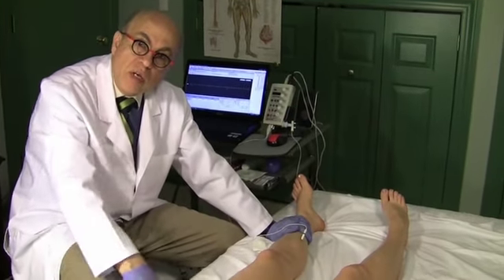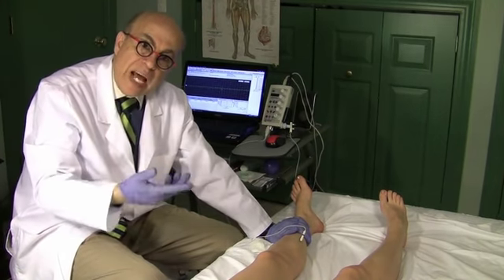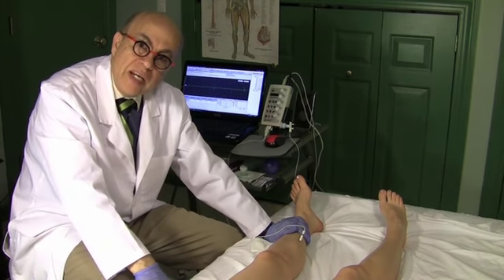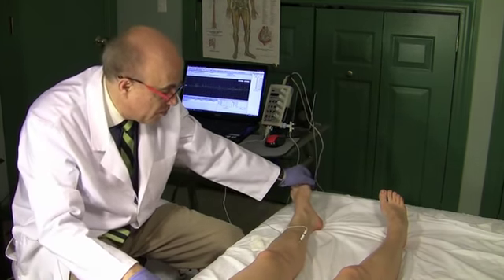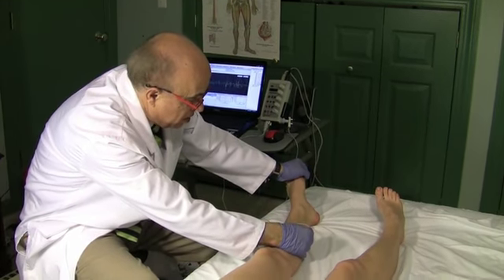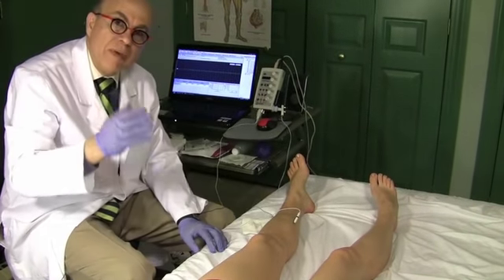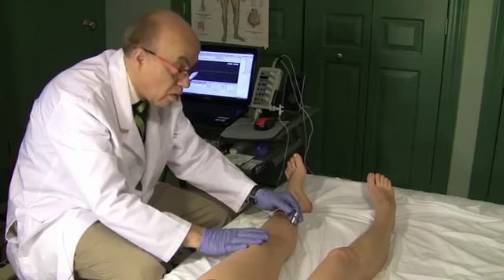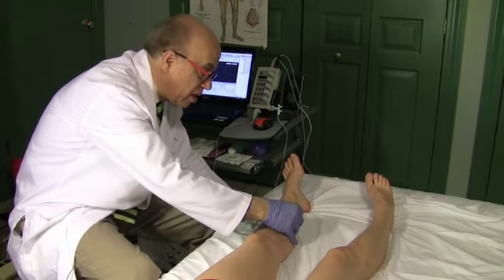One thing I always recommend to my students and residents is whenever you're doing studies, get yourself used to listening to the sound of the motor unit to recognize the normal just by sound versus abnormal. Push down on my hand. And this is a very, very normal sound. The abnormal motor unit sound will be thumping, and it will be very, very loud, like a motorcycle idling. And we're done with the medial gas muscle in the leg.